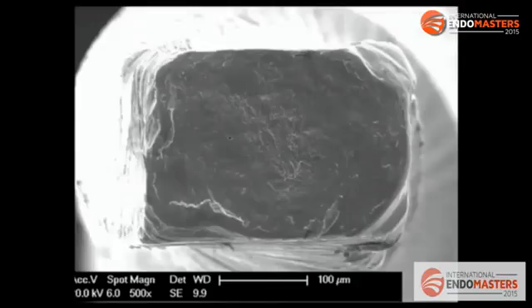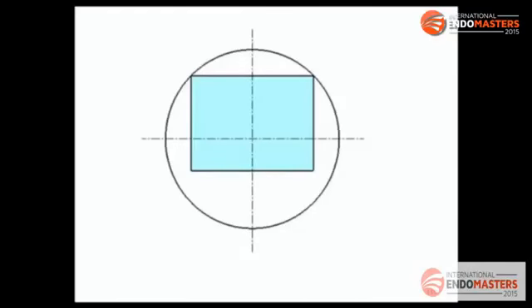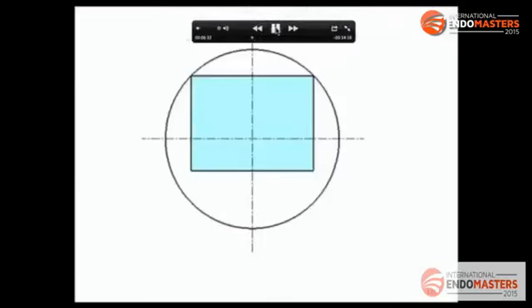This is the change. Now with ProTaper Next we have a smaller core, a smaller cross section, so the file is really more flexible. Also, the change is that before we had a standard nickel titanium, and now we have M-Wire alloy. As I told you before, this alloy makes our files also more flexible. So these files are going to be really flexible for two things, because of the cross section and also because of the alloy, the M-Wire alloy.